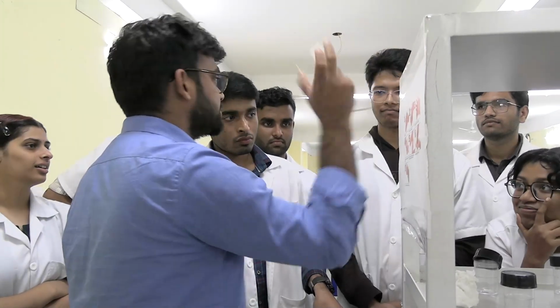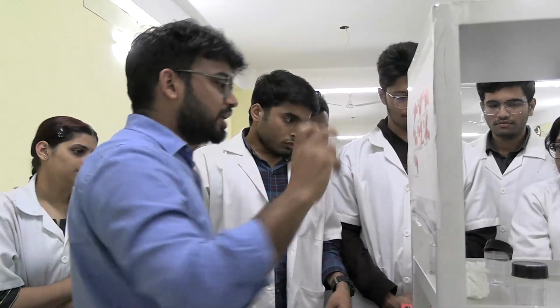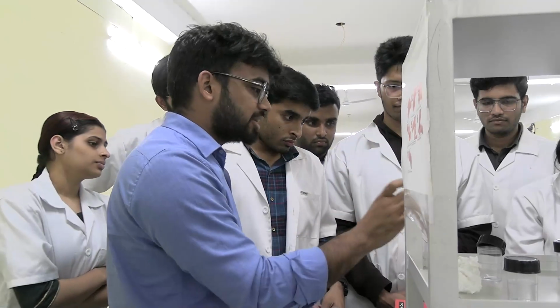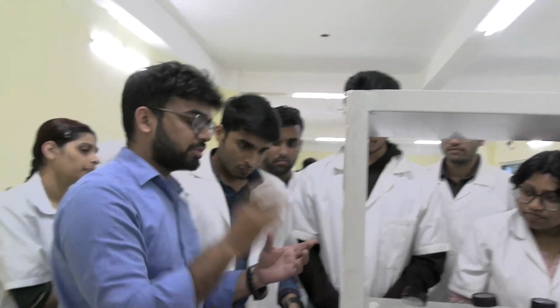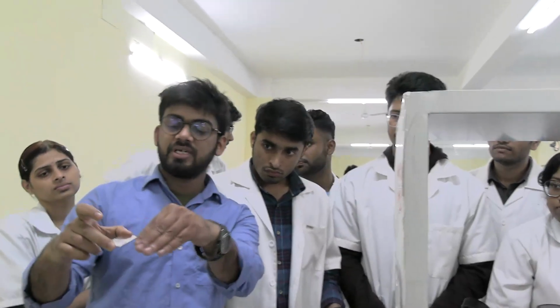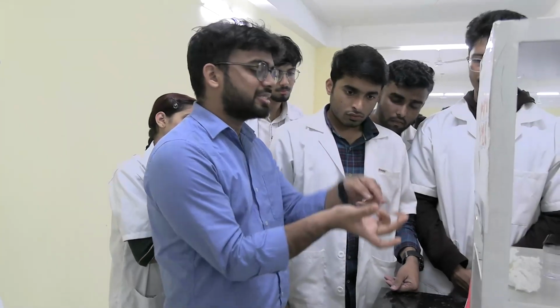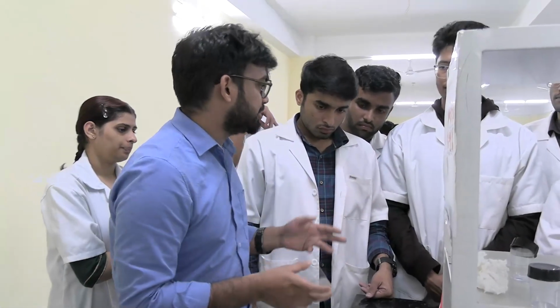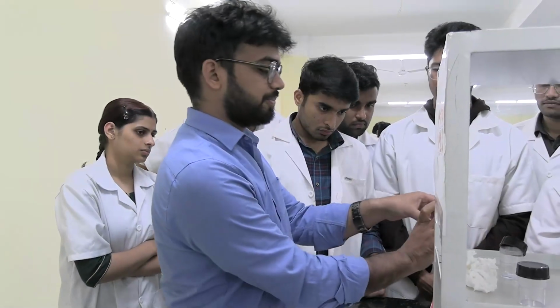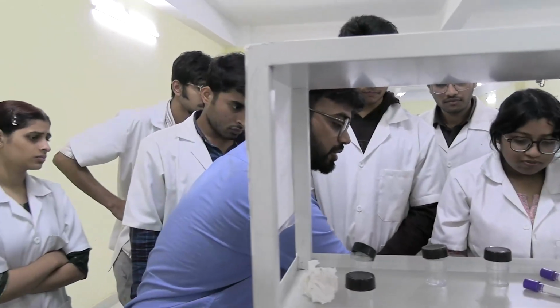So it is dry now. What is the next step? You're going to place it on the rack. Which rack? The staining rack. You should remember that this part was the upper. The smear is here only, the smear isn't here. Some people make the mistake, they don't know which one is the upper part and put the stain here, and it will not do anything. It will not be any use to you. So I'm going to place it like this. Here only. Now what are you going to do?